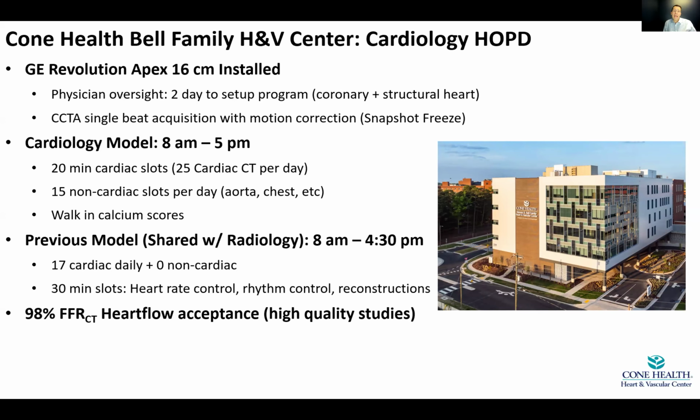The technologists really like it. Again, they don't have to interpret the ECG. There's not a lot of decisions for them. They're really able to know what scan protocol they're going to do, a large volume acquisition, and move fast. And it's really helped us move fast with acquisition as well as interpretation.